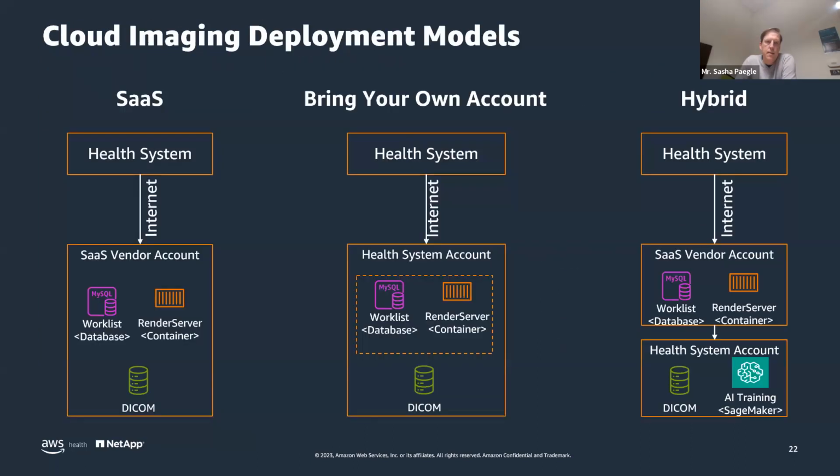So let's move on. And then finally, whether it's a cloud native service or an imaging solution that's delivered by your imaging ISV, it's about thinking about the different implementation patterns in the cloud, in the sense that, are you consuming the imaging service as a software as a service? And really, what does that mean in terms of where you are storing your images and how much control you have over those images?